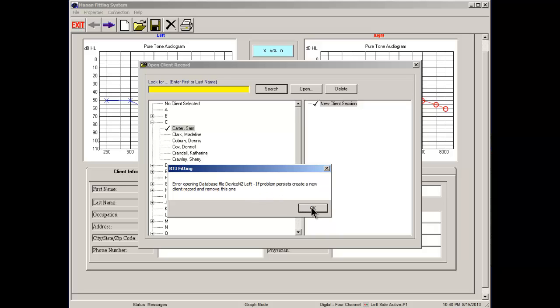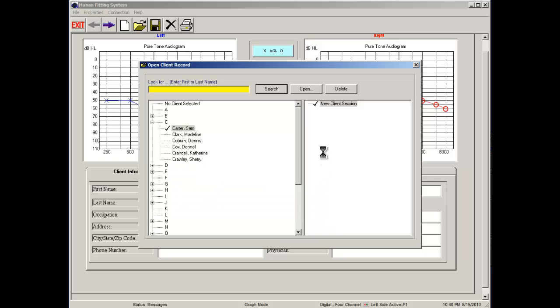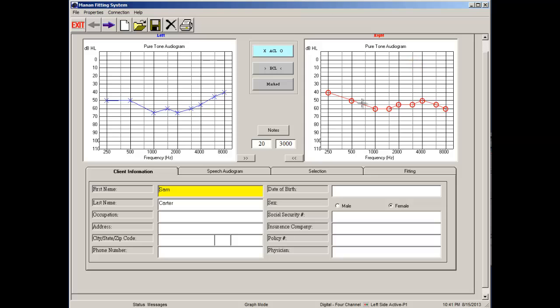So to get past this, you're just going to click this OK button, which is going to close down this error dialog box. And you notice that my mouse icon turned to a loading icon. Mine happens to be an hourglass, but yours may be a little bit different. I've seen some computers have a rotating icon. So to move past this, you're going to take your loading icon and close down this open client record alphabetized list. I'm going to click the X in the upper right hand corner with my loading icon. That's going to close that down.